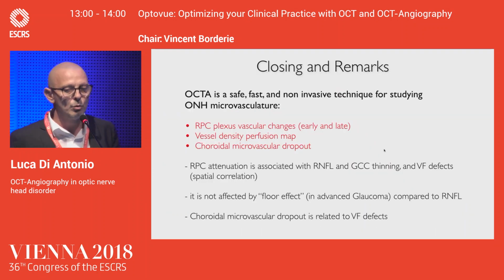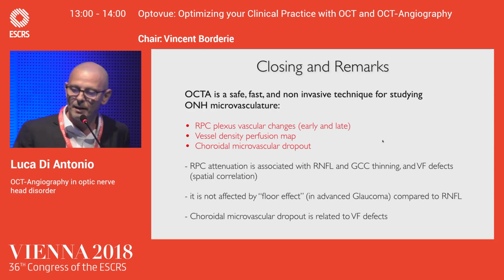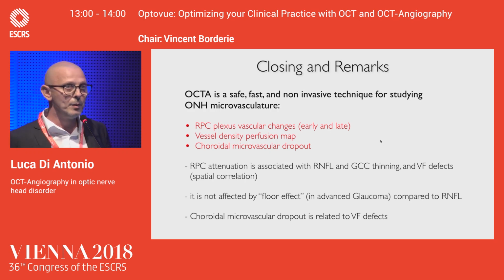So, in conclusion, OCT angiography is a safe, fast, and non-invasive technique for studying optic nerve head circulation. The RPC attenuation is associated with the RNFL and the GCC thinning and visual field defect, and there is a spatial correlation. RPC is not affected by floor effect, like in advanced glaucoma, so it is a useful tool for monitoring these patients in the later stage of glaucoma.